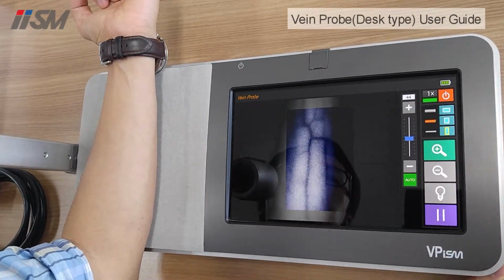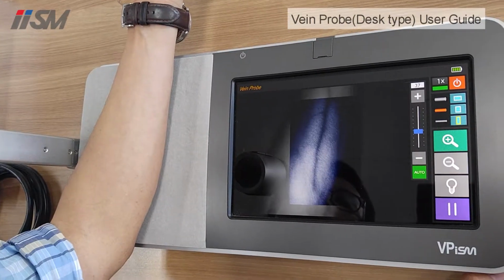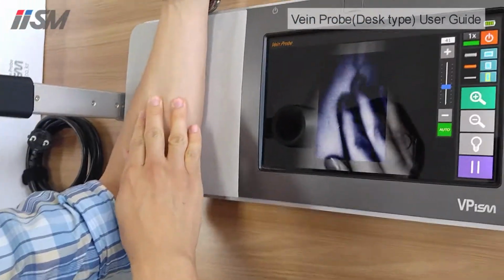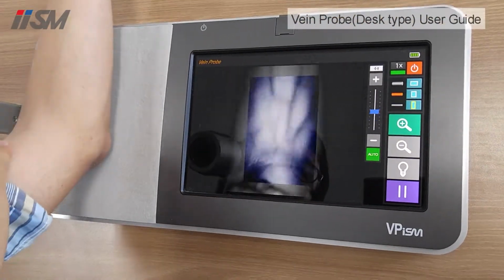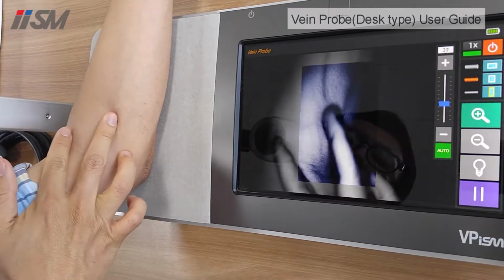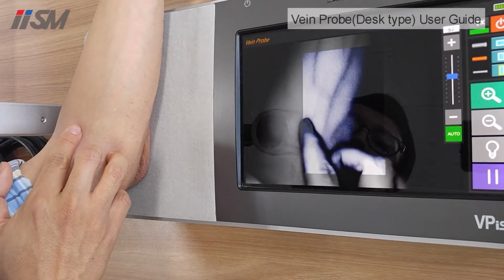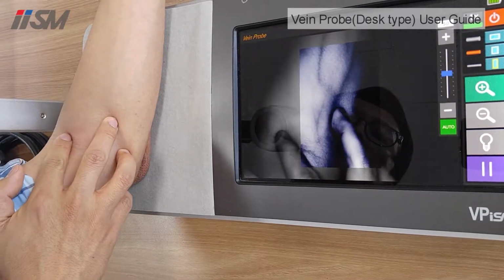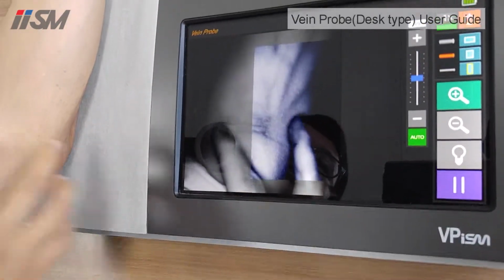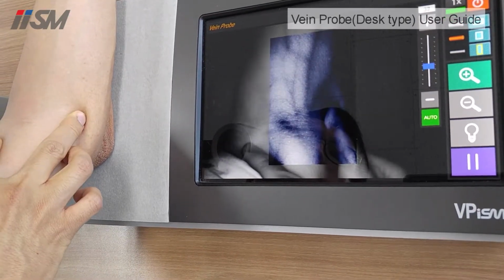If the vein of your patient is very hard to see, in a normal IV injection procedure, the nurses will apply a tourniquet to apply higher blood pressure. Then there will be a higher amount of blood, so it will be much easier to see the vein during IV injection and for injection procedures. As you can see here, for example, like that. You can also stretch the skin to be closer to the vein. For example, here, this is very faint right now, but if you apply some more pressure, you see that it becomes clearer. So for those, this will be very helpful when performing intravenous injections. You can see the thick veins also here.